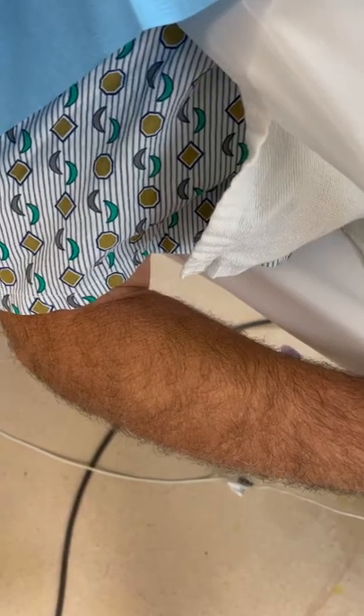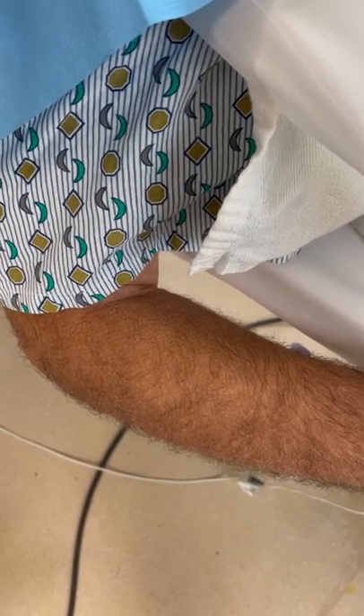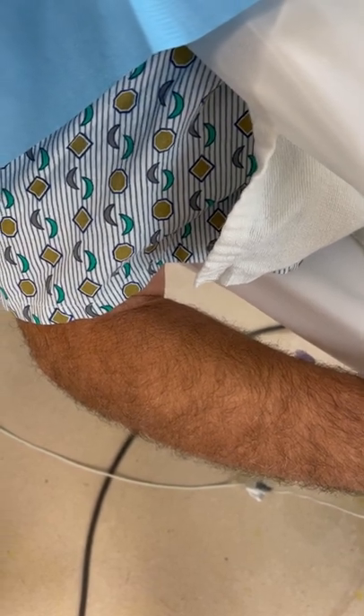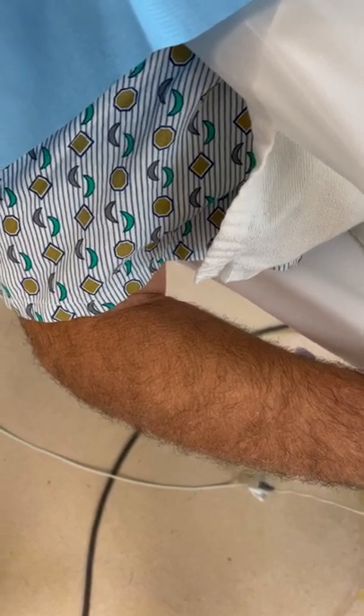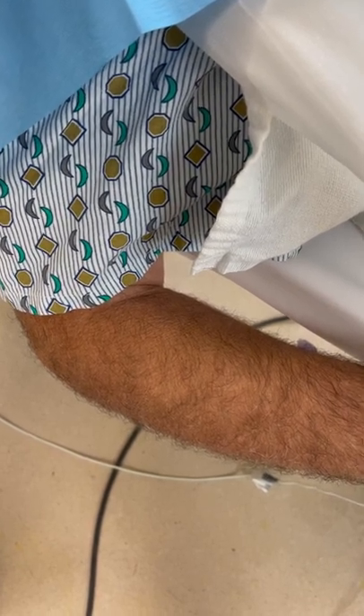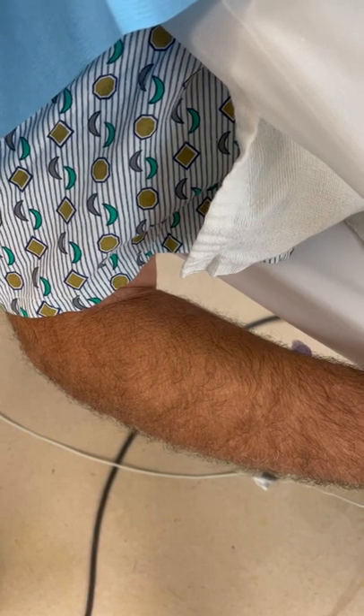You see we're stunning the nerve with the slight twitches on the muscle on the C6 distribution, and this is for a patient who has radiculopathy in the cervical or lumbar region down the arm or leg to help alleviate any pain of this type, and we can get good results.